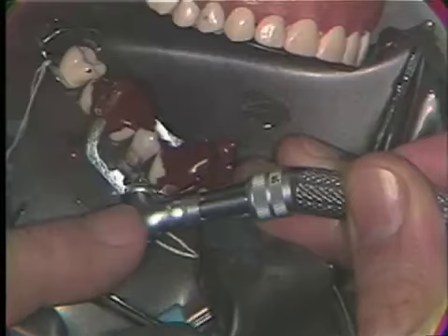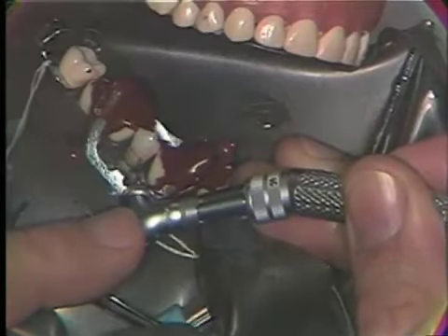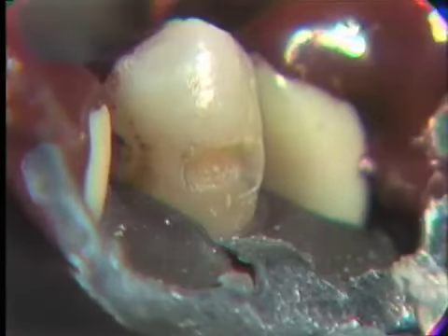As we stroke, we have the burr turning, in this particular case, in a counterclockwise position. We're stroking up that mesial wall. And now we are going to come across the occlusal wall with a proper taper. Try to rest on the arch that you're working on always.